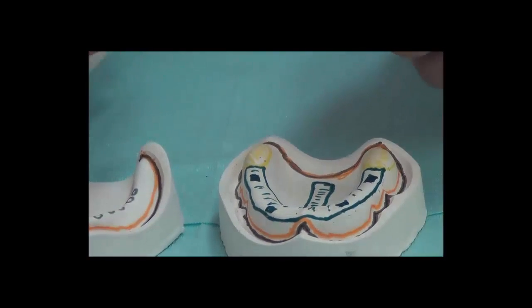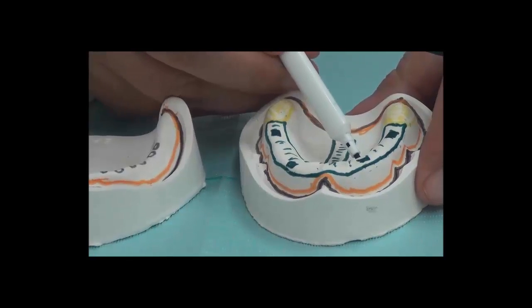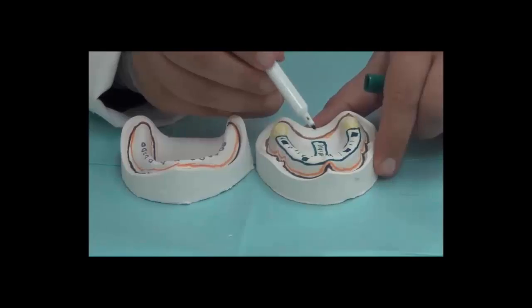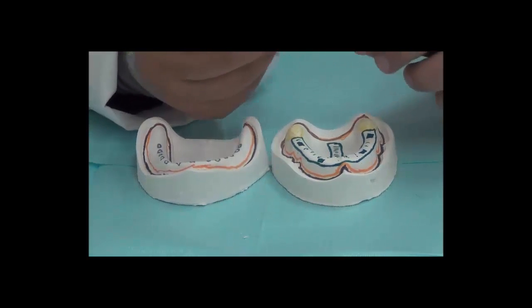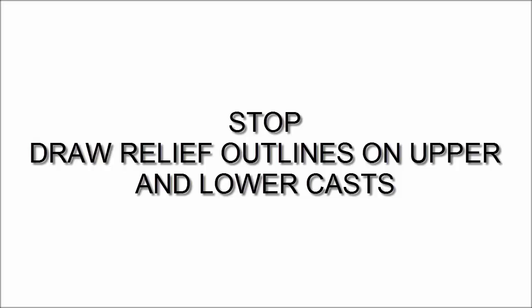Now you're ready for the step where you're going to draw the outlines and then consult with your supervisors and helping staff with the outlines, that they are sufficient for the purpose. You have 10 minutes to do.